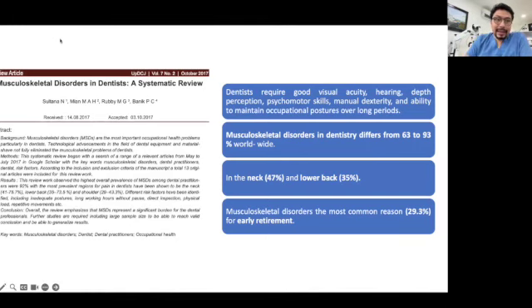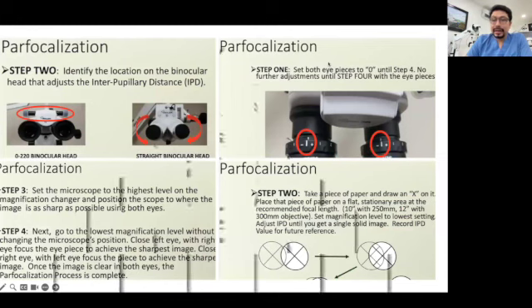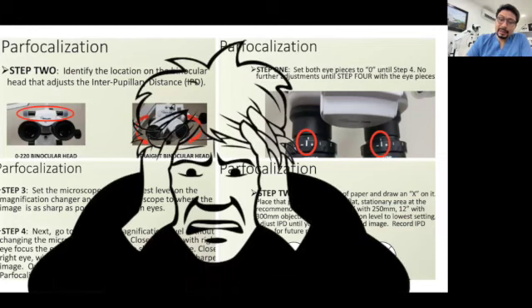That's why I say that the first one taking advantage of the microscope is the dentist. It's a tool for you. It's a tool for feeling more comfortable, for getting all the advantages. And the main problem is this. I have some friends who already made the investment. They decided to buy the microscope, but they are frustrated. They are very frustrated with the regular microscope.